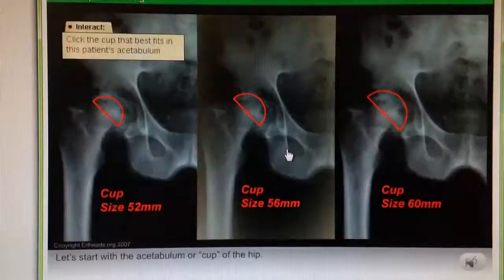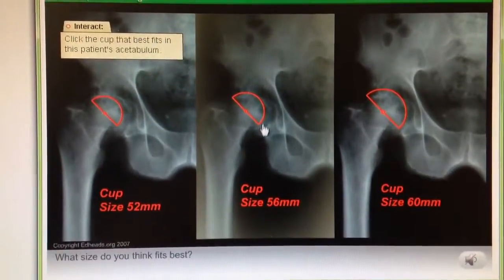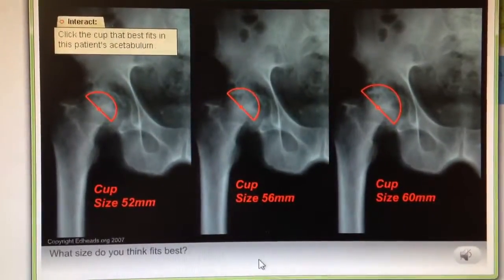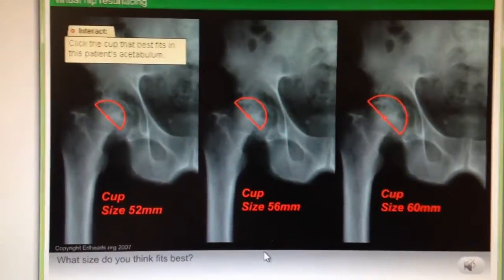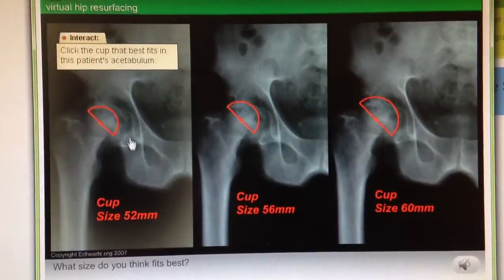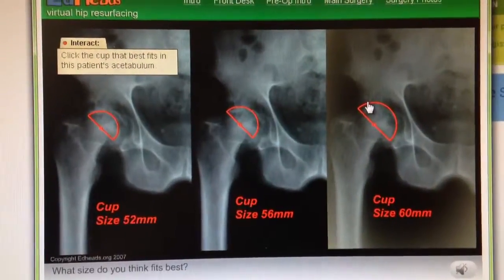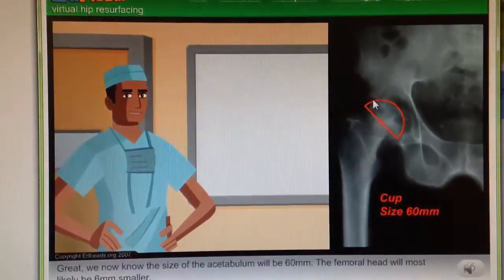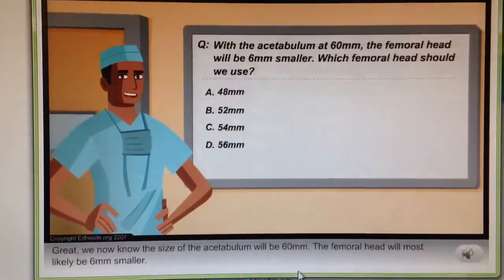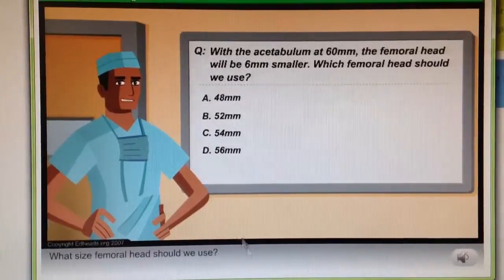Let's start with the acetabulum, or cup, of the hip. What size do you think fits best? Great! We now know the size of the acetabulum will be 60 millimeters. The femoral head will most likely be 6 millimeters smaller. What size femoral head should we use?